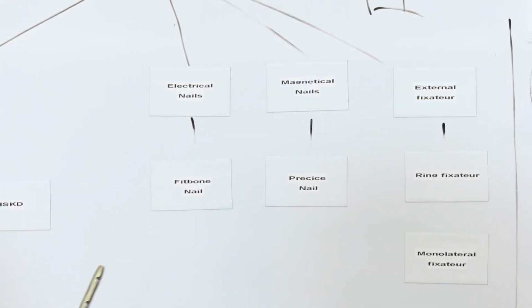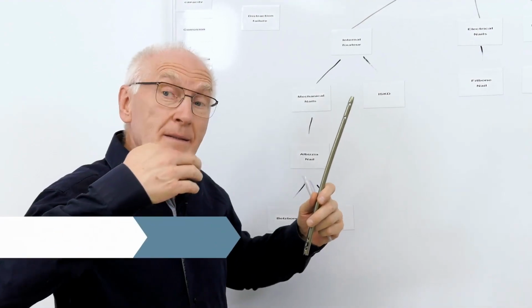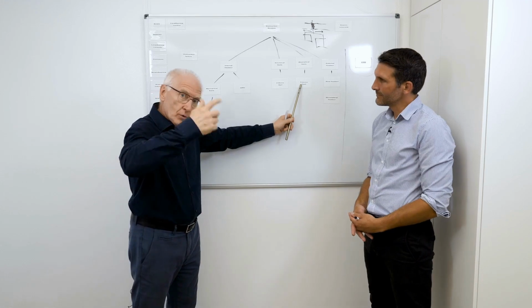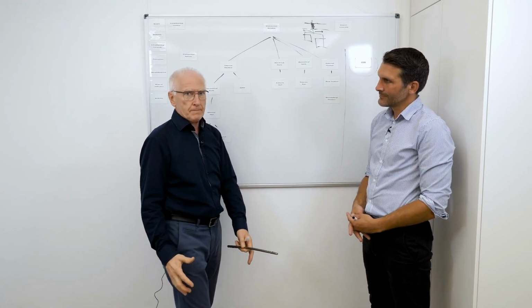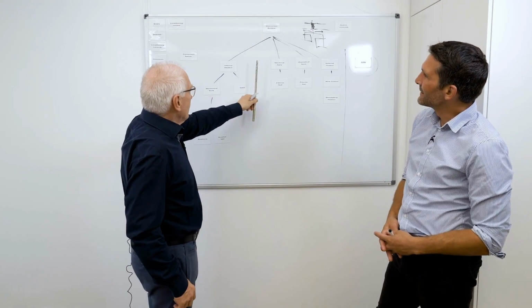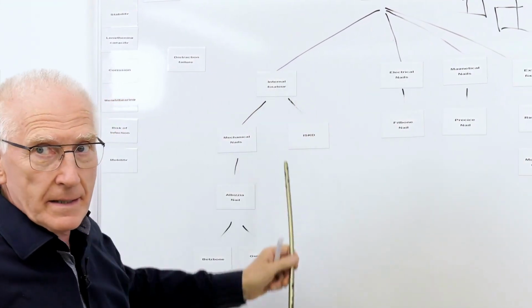In the Precice nail, the rotational components are inside, which move the nail apart. It's the same with the Fitbone, but there the motor and anchor are deep inside. Here, only the rotational component is inside, and the magnetic field comes from outside. So it has been relocated. Here, one must make a very clear distinction, in principle, between the electric and magnetic nails and the mechanical ones.